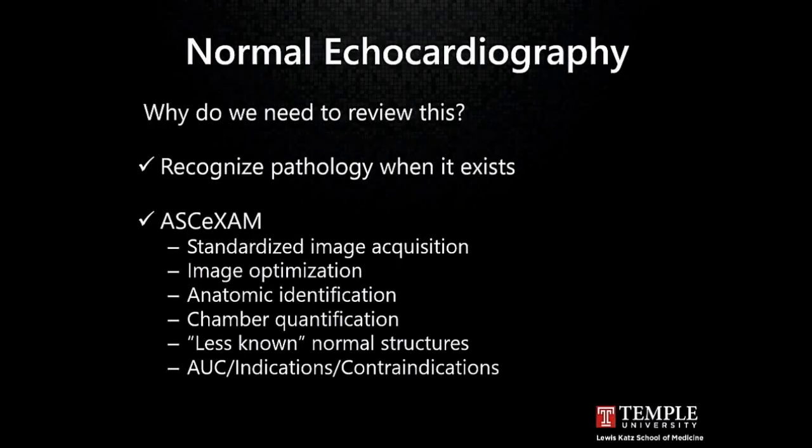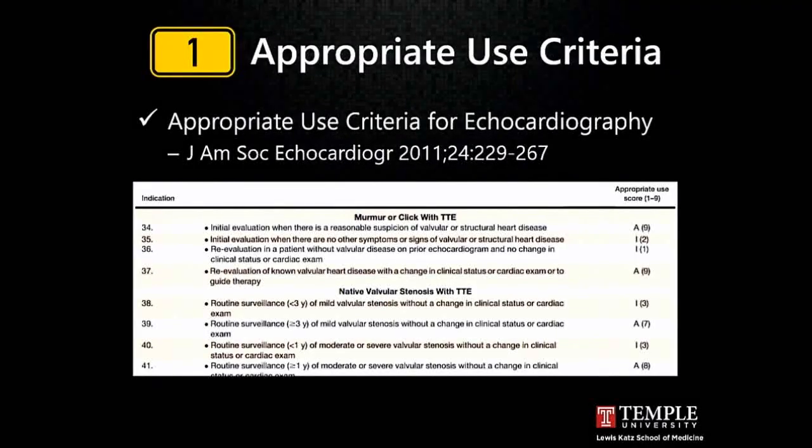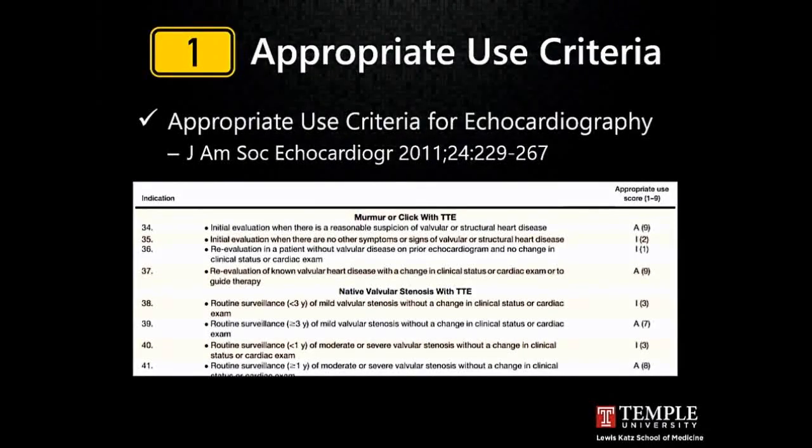And then also do echocardiograms appropriately and by our guidelines, with appropriate use criteria in mind, doing them safely when we're talking about transesophageal echo, in terms of indications as well as contraindications to these studies. These are all testable ASC exam type of topics that you should keep in mind when you think about the normal exam. So two key documents that I'd like you to be aware of for the exam.